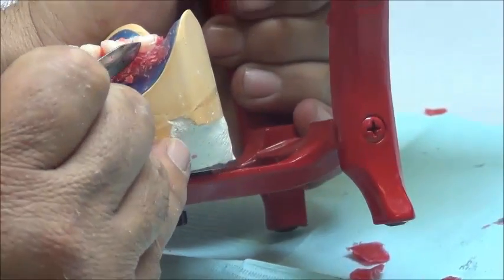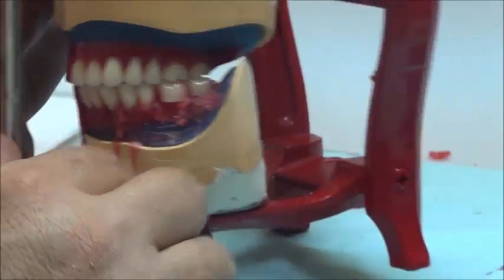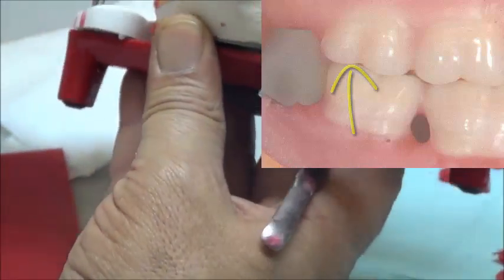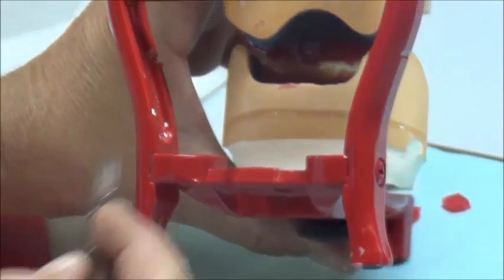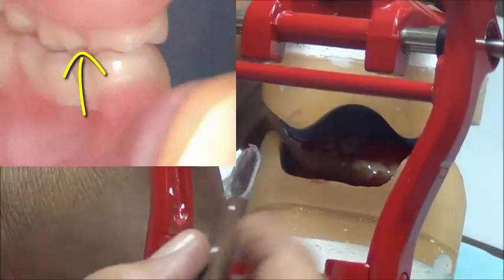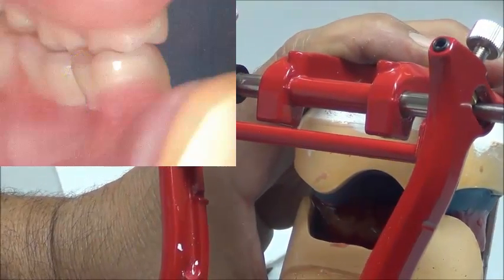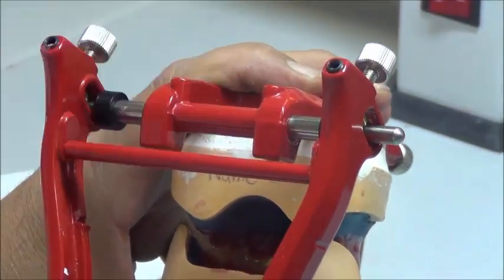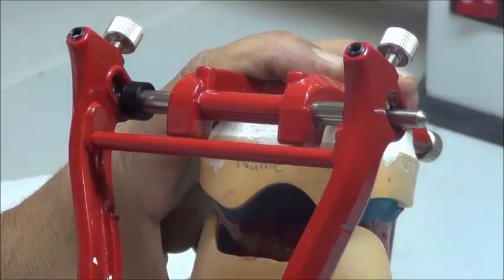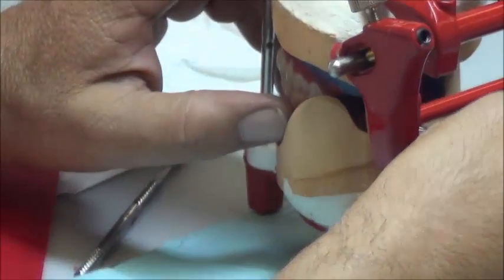So we finalize its tilt. We remove excess wax. We make sure it's interdigitating with the upper perfectly. If it's not, we just raise it from beneath. So I stab the knife beneath it, and we go lingually and watch what to do. We try to take the tooth up by raising the lingual cusps to embrace the upper. Okay? So the tooth totally is with total contact with the upper 7. So we make sure the interdigitation, I could see no space between the teeth, and now also I don't see them buckling.